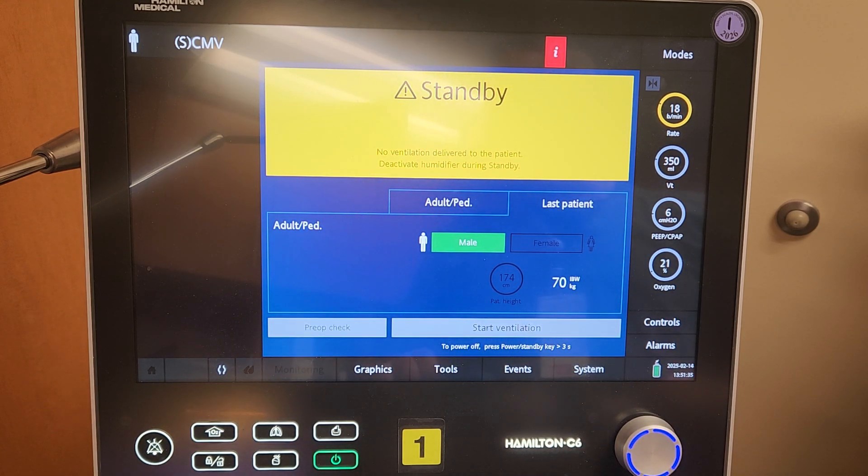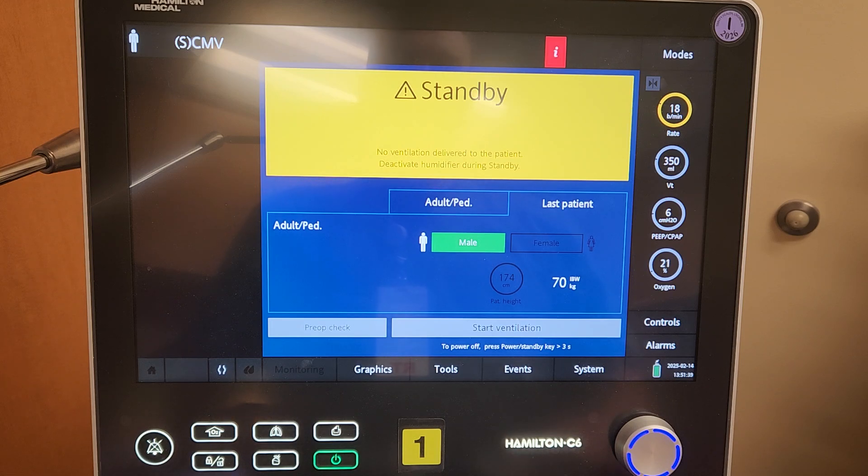Hi there, this is Scott with St. Al's Boise Respiratory Care. I'm going to be going over a few tidbits with the Hamilton C6 — some buttonology, modes, and things to know about this particular ventilator.